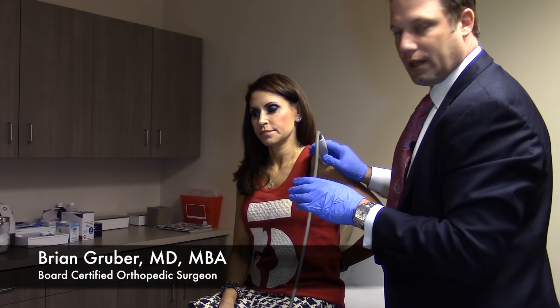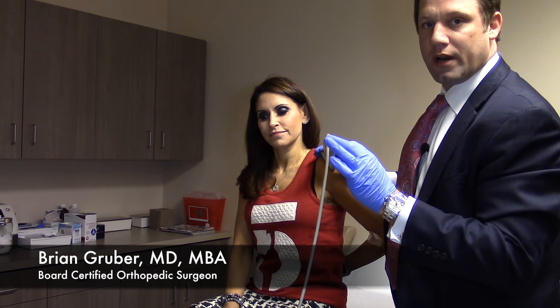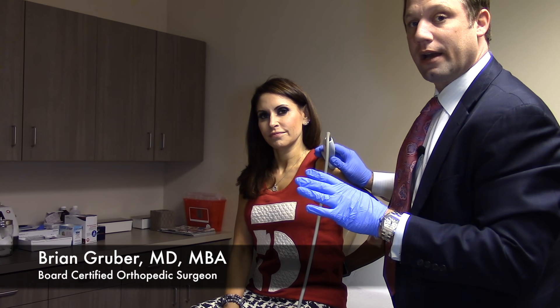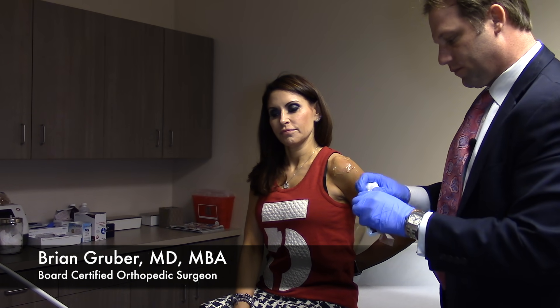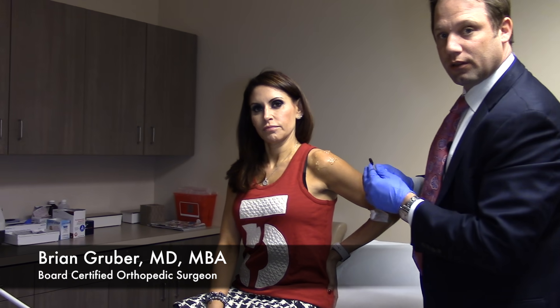Now we're identifying and isolating the area of abnormality in her rotator cuff. What Julie has is an area of tendinosis — there are different types of tendon pathology of the rotator cuff: one is a tear, and she does not have a tear, but she has tendinosis where the quality of her tendon is abnormal in one area. We'll identify that under ultrasound and inject PRP directly there. She's in what's called the modified Crass position, which helps bring the rotator cuff into better view for access.